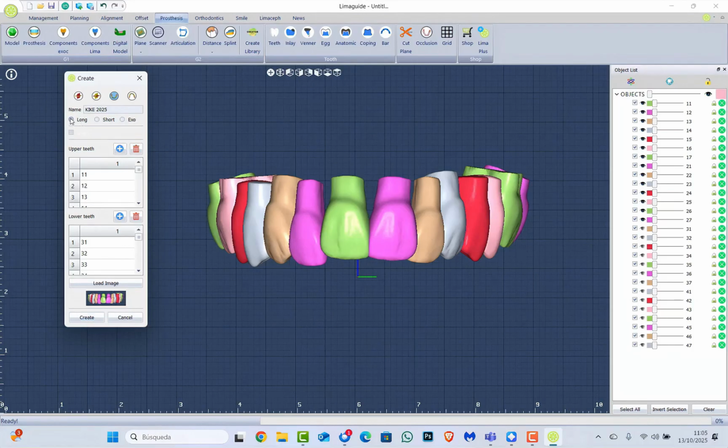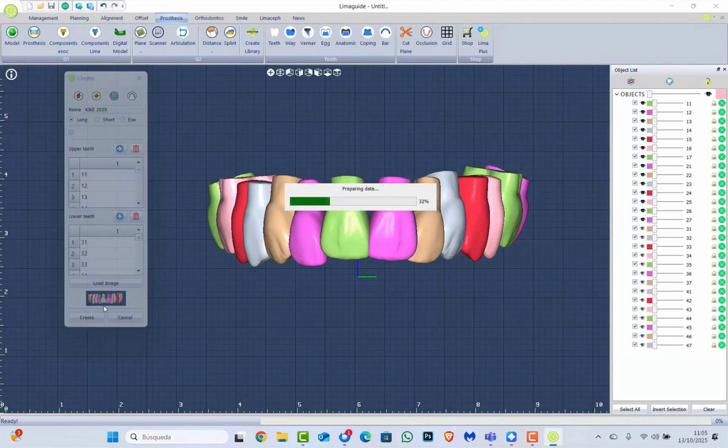And by the way, here we have to select if our teeth are long, short, or exo. I'm going to choose the long size since we can see a little bit of the root of the teeth. Then I'm going to click on create and we've got our new library.